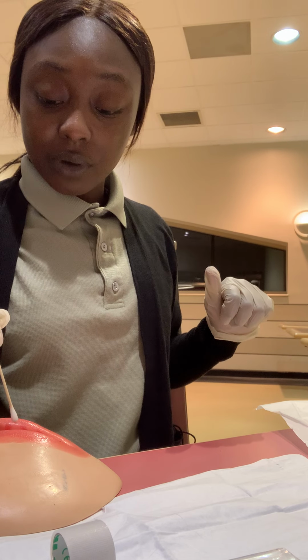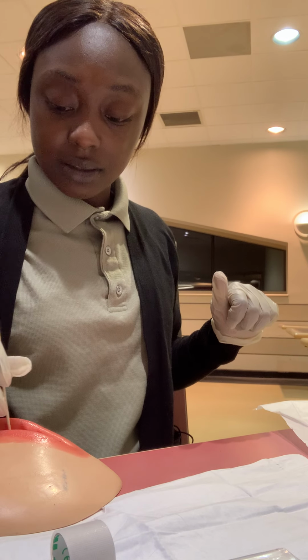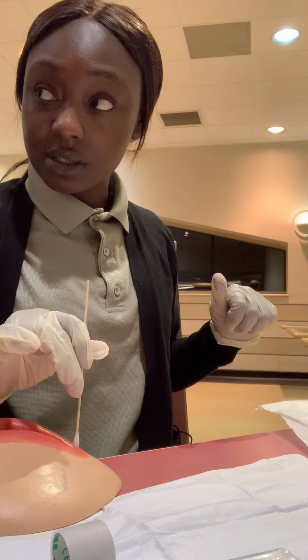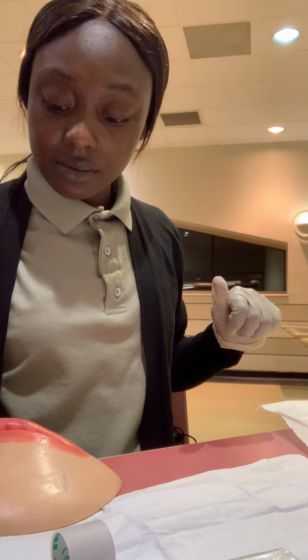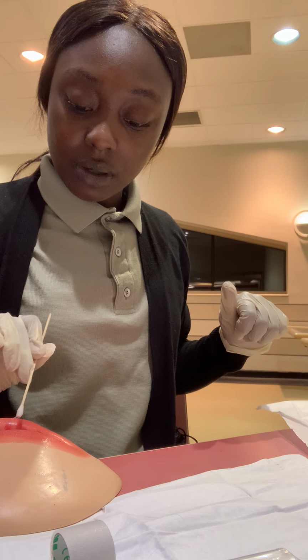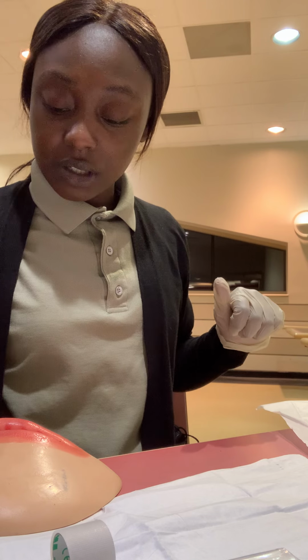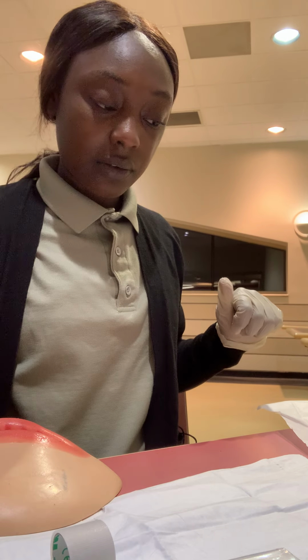So when I clean, I'm going to go from center to outside, center to outside, center to outside. You don't want to scrub too much, just enough to get everything off.